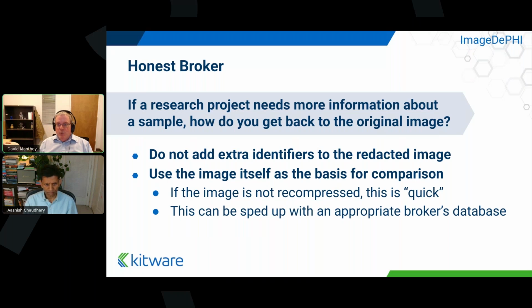That's still at the organization that did the redaction. You could theoretically save this in a database to be faster, but then that database is something you absolutely must keep secure. That's got to be inside your protected zone that has PHI in it, or has data that lets you get to PHI in it. So that has to be protected.